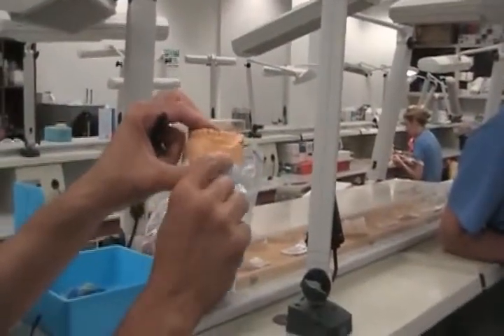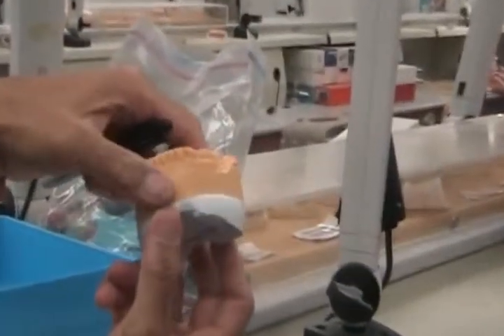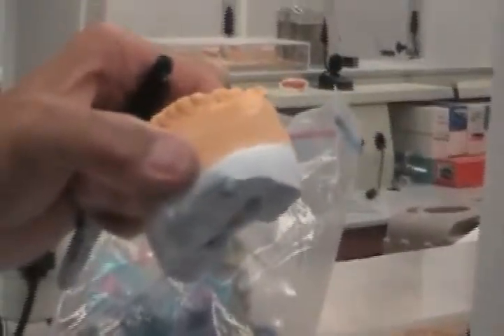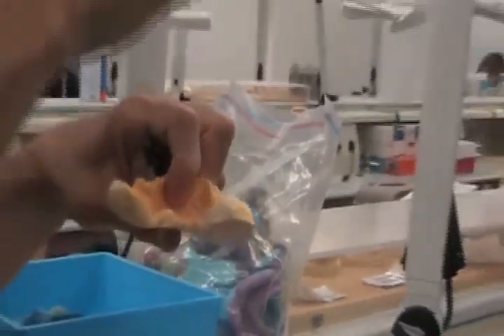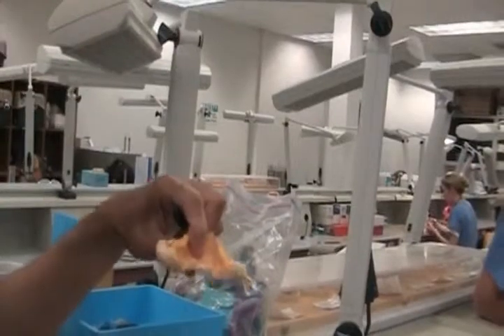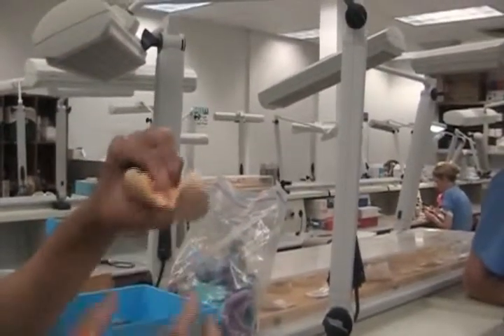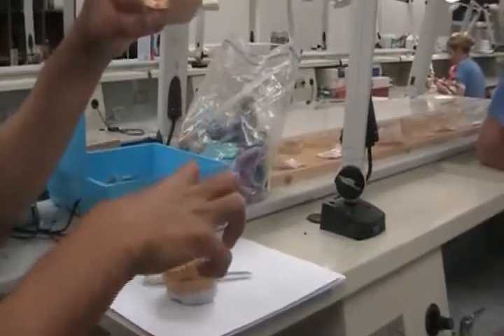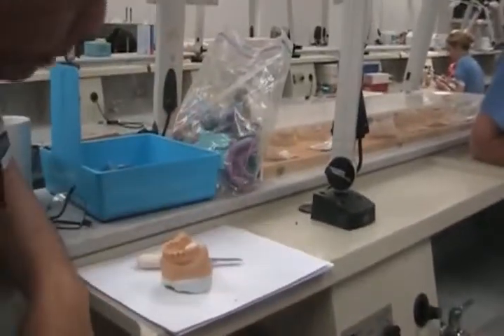Notice the two layers this guy had — it was too thin. So from the start we have to watch this. My criteria when you're pouring something is: whatever the lowest point in that impression is — or the highest point, which translates to the lowest point on the cast — I need about a half inch from that down to the base. Anything less can make the cast fracture when I try to separate it.